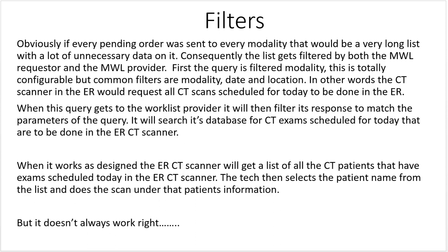First, the query is filtered by modality. This is totally configurable, but common filters are modality, date, and location. In other words, the CT scanner in the ER would request all CT scans scheduled for today to be done in the ER. When this query gets to the worklist provider, it will then filter its response to match the parameters of the query. It will search its database for CT exams scheduled for today that are to be done in the ER CT scanner. When it works as designed, the ER CT scanner will get a list of all the CT patients that have exams scheduled today in the ER CT scanner. The tech then selects the patient's name from the list, and does the scan under that patient's information. However, it doesn't always work right, and that's why we have a job.